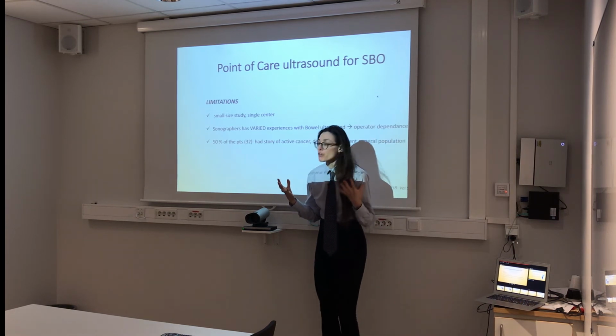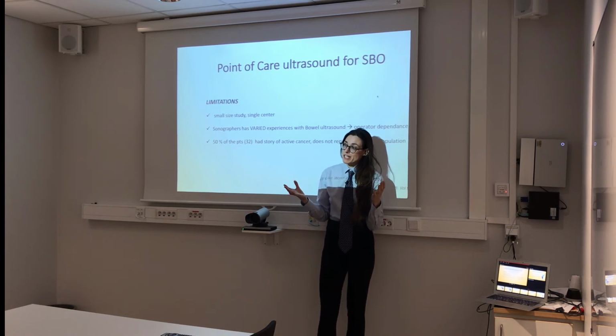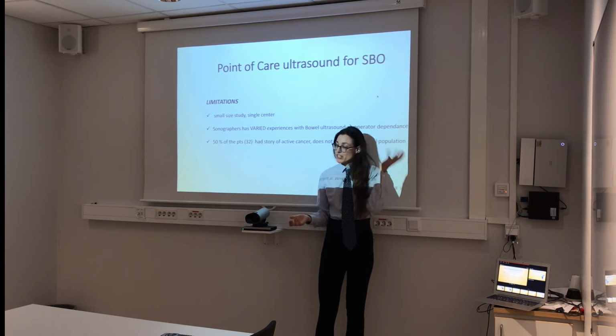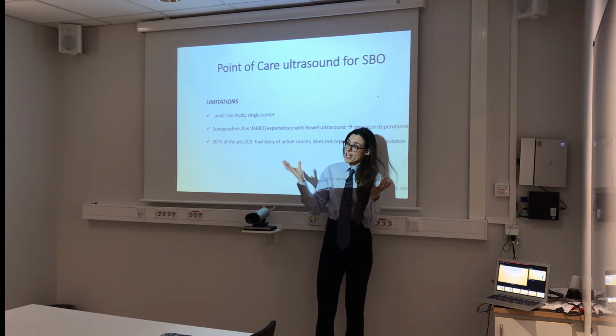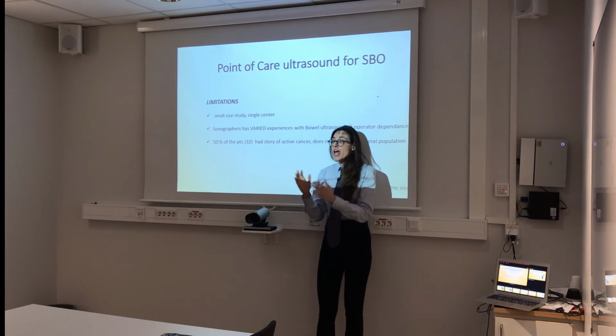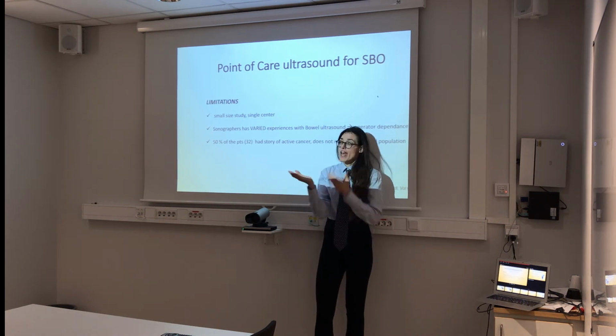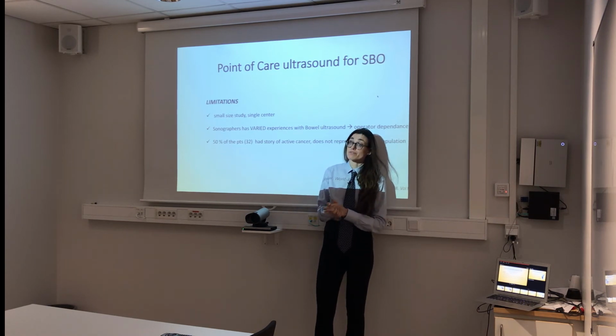So the big bias, the problem with the point of care ultrasound study, is when we got basically different people from different backgrounds doing ultrasound. So you don't know how much is the preparation of sonographer number 1 and how much the skills of sonographer number 2. Because probably in that group of indeterminate, if the sonographer was very skilled, we didn't have 8 indeterminate. It was just no SBO as an answer. And this is a big difference. Because no SBO and CT scan no SBO increase the sensitivity and the specificity, right? Whereas indeterminate, we cannot say anything.